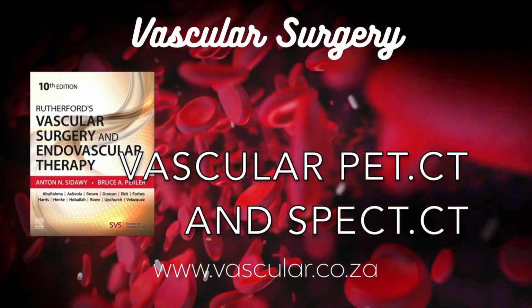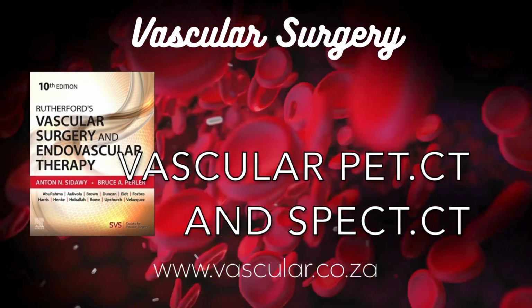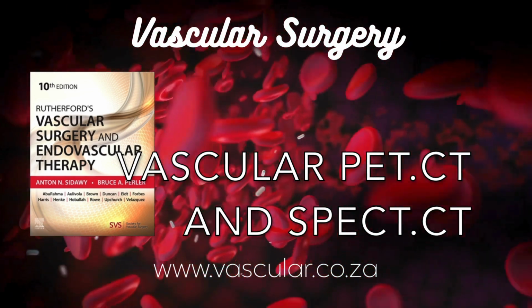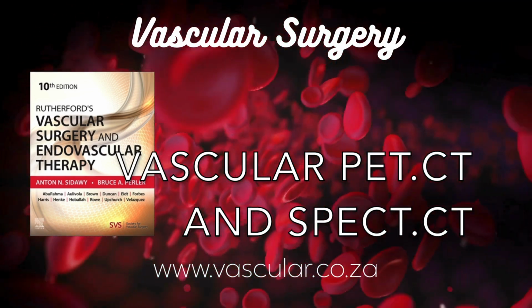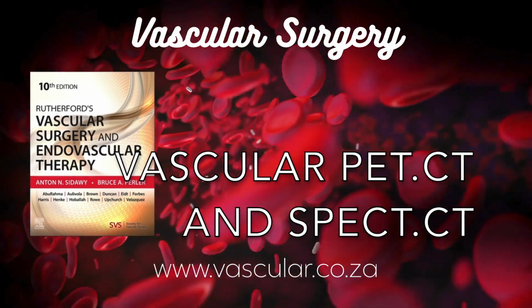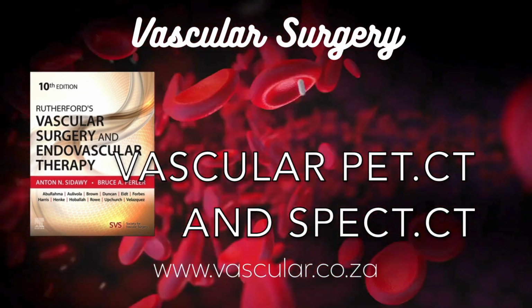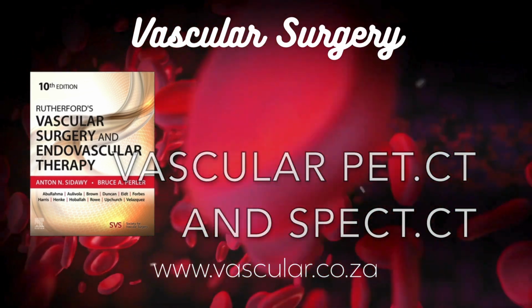Now, broadly speaking, what are the main limitations or risks we should keep in mind with these molecular imaging techniques? Well, we've touched on spatial resolution. It's good, around 4 to 5 millimeters for PET, but not microscopic. Hybrid imaging helps localize, but you're still limited by the PET or SPECT resolution itself. Oh, right. Developing new, better tracers, as we discussed, is a constant challenge. It's a slow, expensive process to get them from the lab to the clinic.